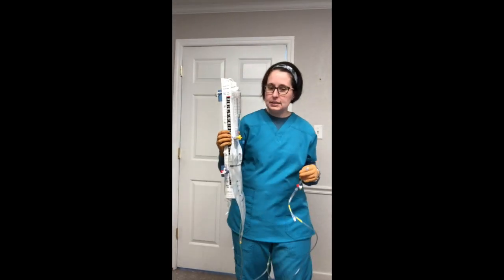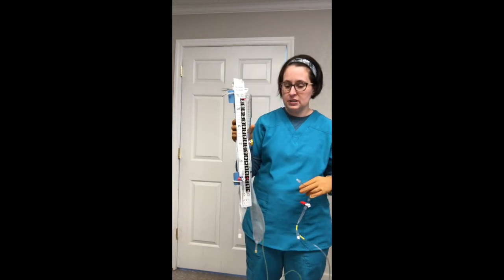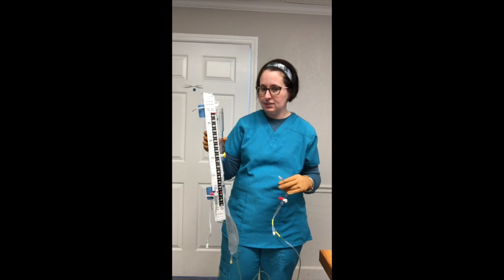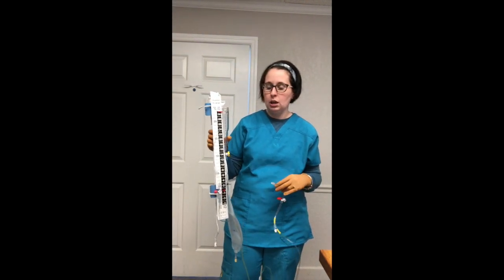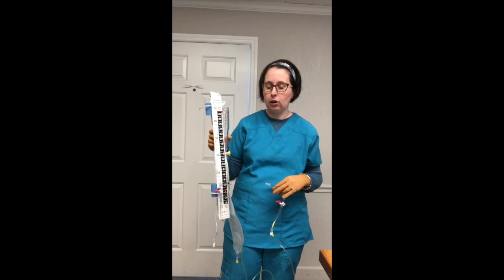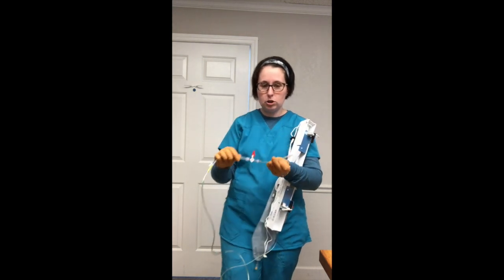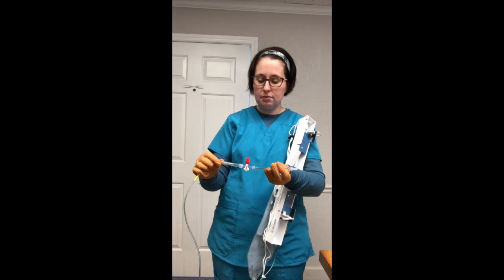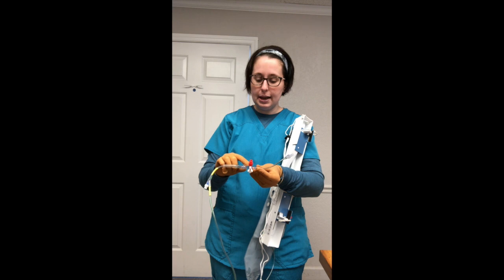If troubleshooting is needed because output has decreased, the first thing you would do would be to lower the system below the level of the patient and see if output increases. If this does not work, then you would need to gather supplies for additional troubleshooting. You would gather a sterile towel, sterile gloves, a mask, a sterile syringe, saline, and betadine. You would lay this portion on the sterile towel. You would don your sterile gloves and your mask. You would then proceed to clean your site with betadine.